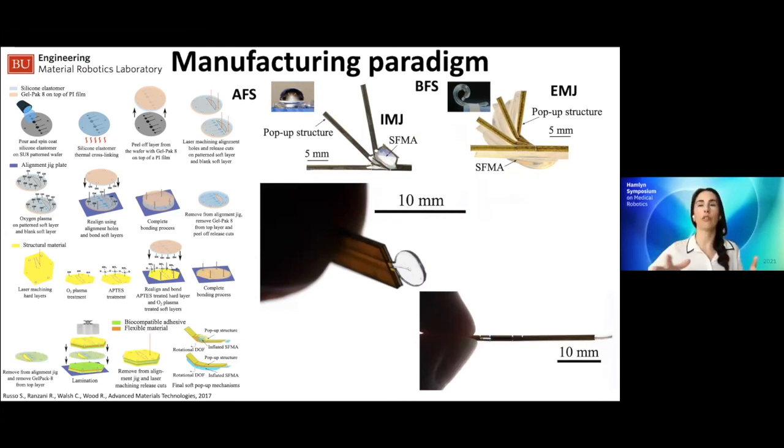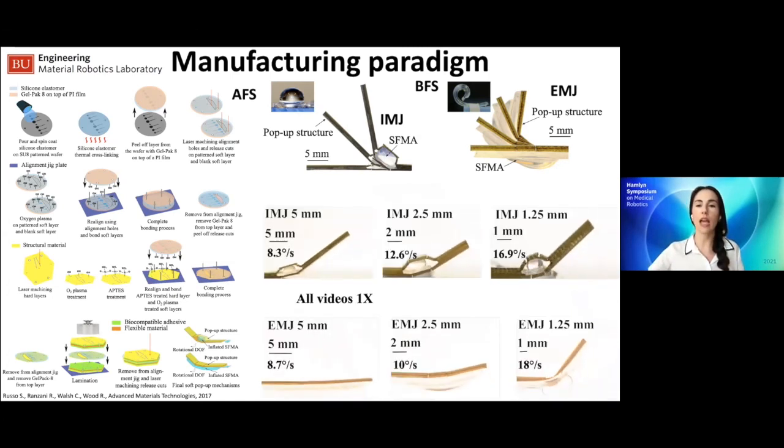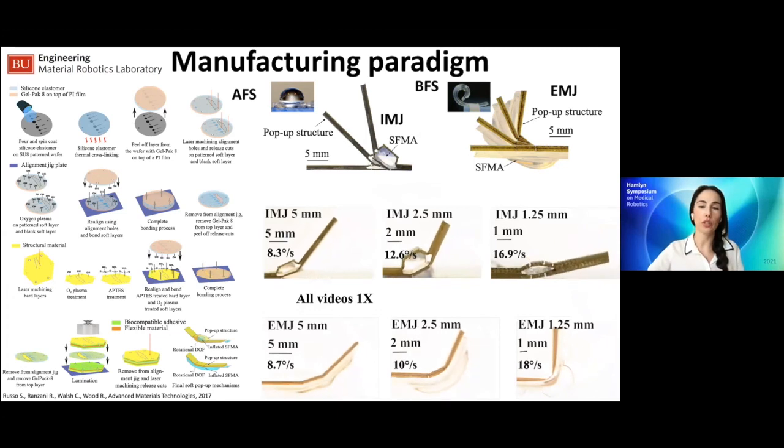We have gone through different levels of miniaturization, from a few millimeters down to 1 millimeter, with the idea being that, again, these can be passed through the working channels of current medical instrumentation or be mounted outside current medical instrumentation. And so we wanted to make sure that the size of our robotic systems would be compatible with those kinds of applications. And this is how they behave upon inflation, basically.